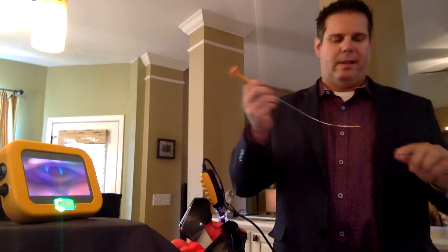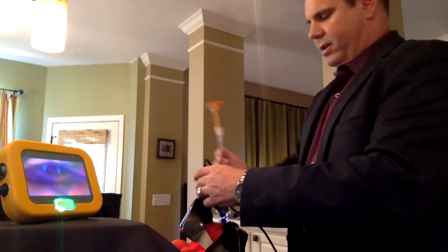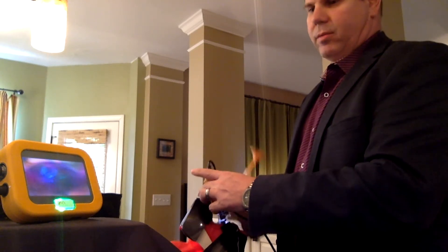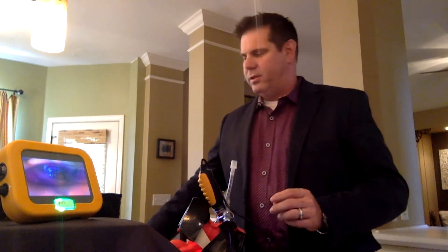The next thing is to use our reusable rigid stylet for intubation. You want to use that every time. You can use the malleable stylets, but the reusable rigid one works much better. These are very aggressively priced, so you can buy those from us.